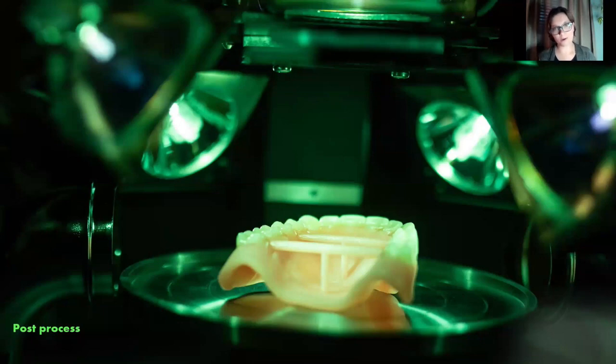Usually we'll call all those steps after getting it out of the printer, post-processing. So you'll bond the teeth, you'll cure it at the appropriate temperature and the appropriate wavelength of light for the appropriate amount of time. And then you create a denture. So that's how a denture is born.